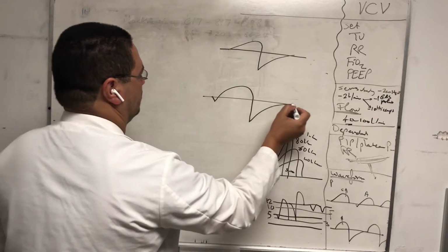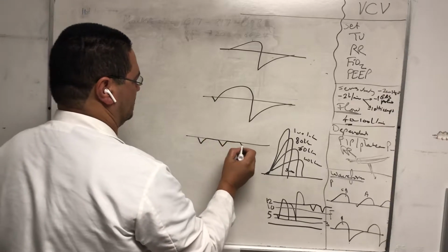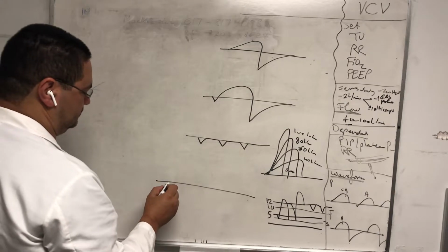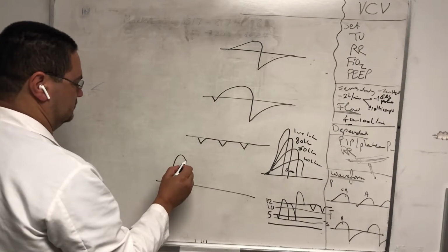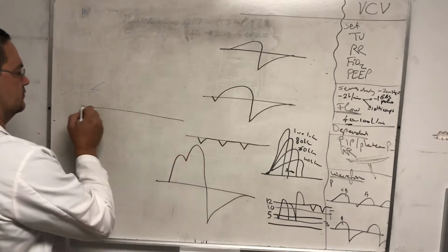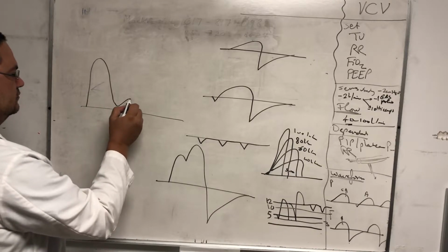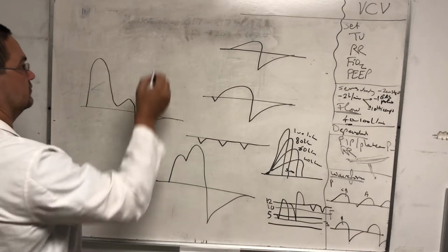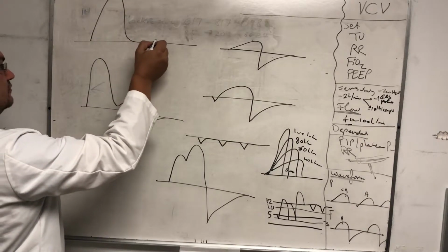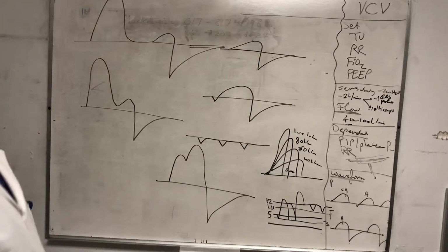This is all flow waveforms. Okay, so what is this?